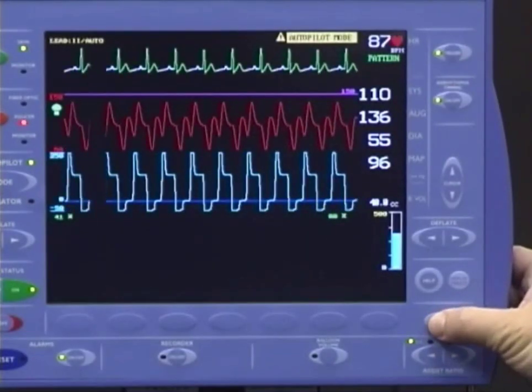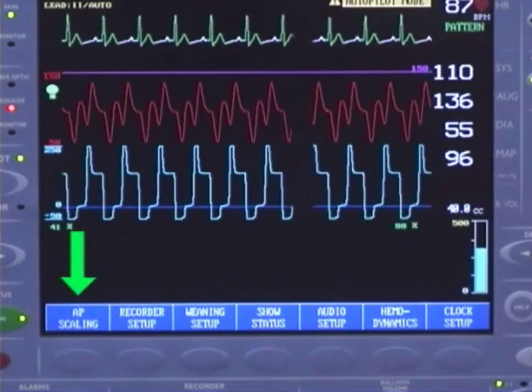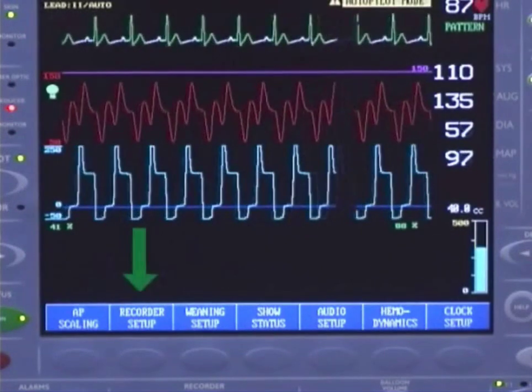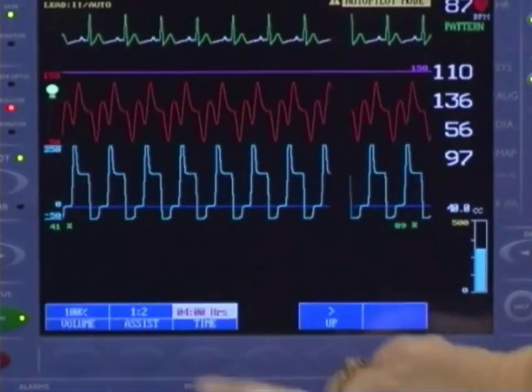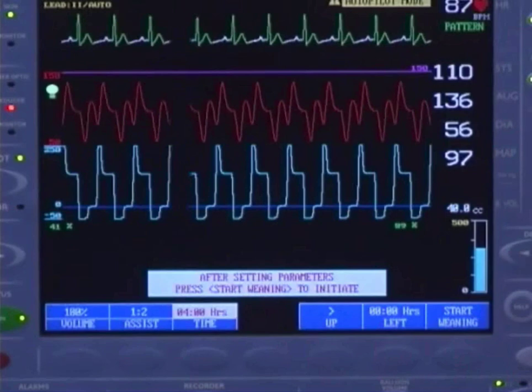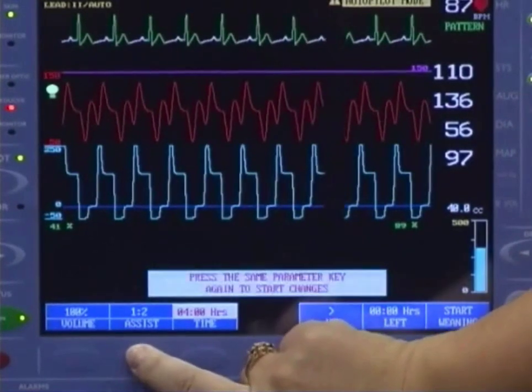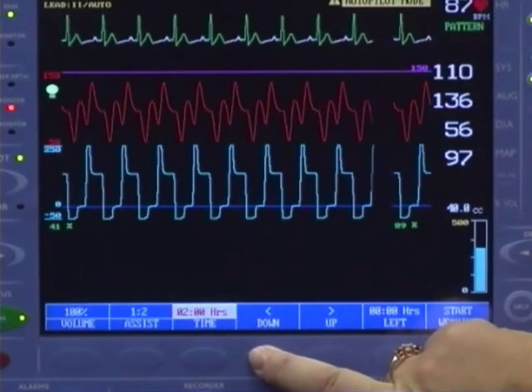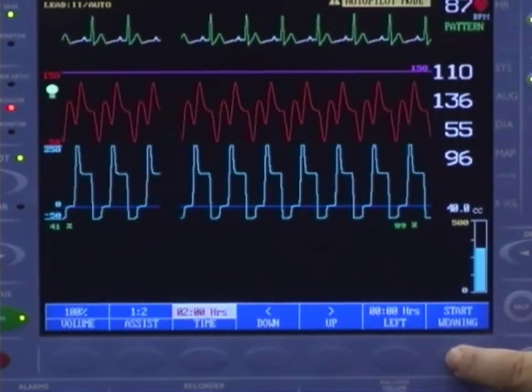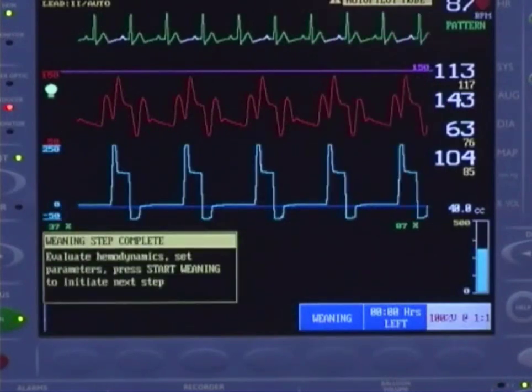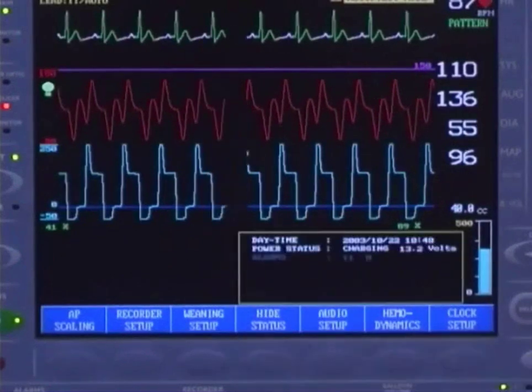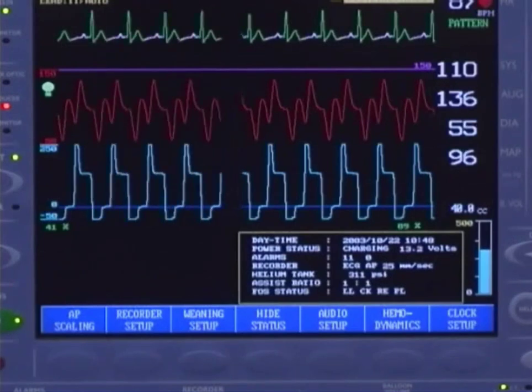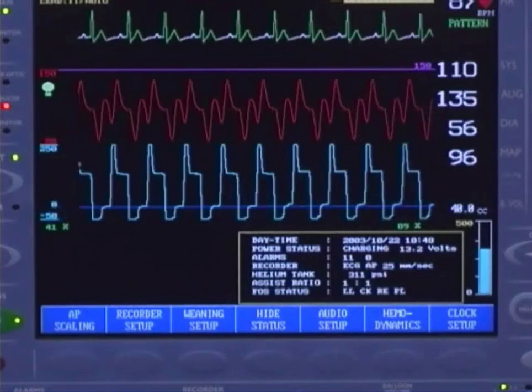Additional operations can be found by selecting the Home key. AP scaling options are available when the Home or AP select key is pressed, and the function and settings are the same for each. Under Recorder Setup you can configure waveform printing. In Weaning Setup, you can program the pump to institute a weaning step — options include changing balloon volume and/or assist ratio and the length of time for the weaning interval. Activate by pressing Start; the pump will alert you when the time period is finished. Under Show Stats, you will find pump status information including battery voltage, current pump settings, helium level, FOS status, current assist ratio, and the code for the last alarm.